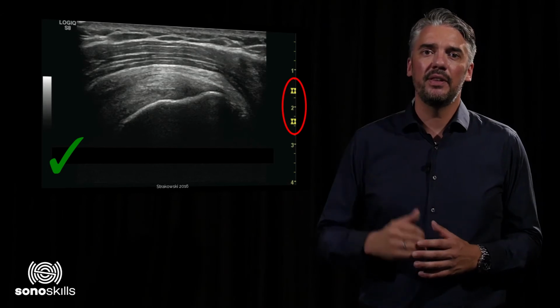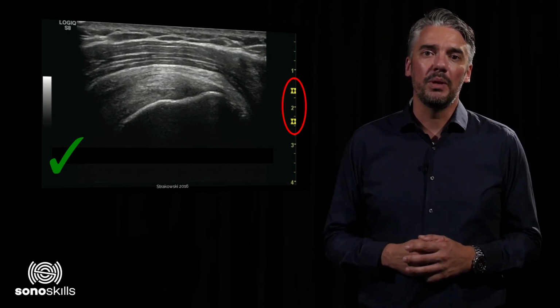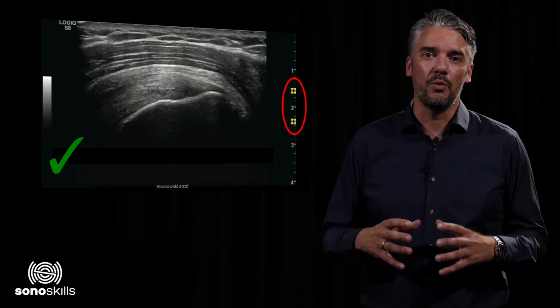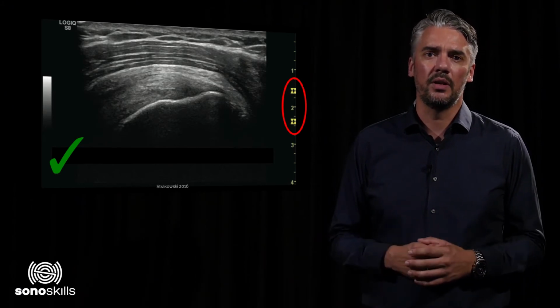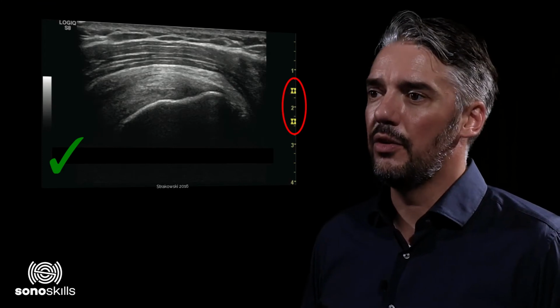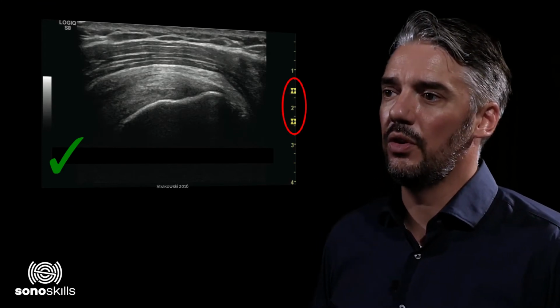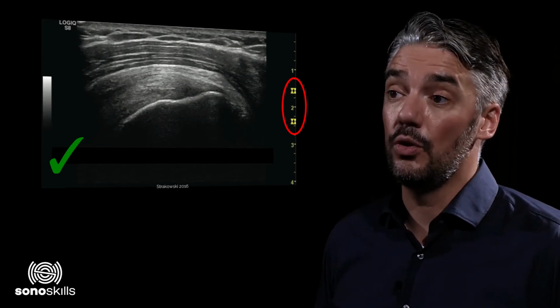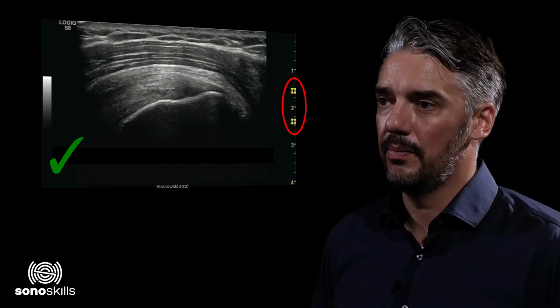Everything above this level on the screen will be within the Fresnel zone and will therefore lie within the region of relatively high resolution. Failure to maintain the focal zone in the proper location while scanning will result in decreased resolution at the point desired.